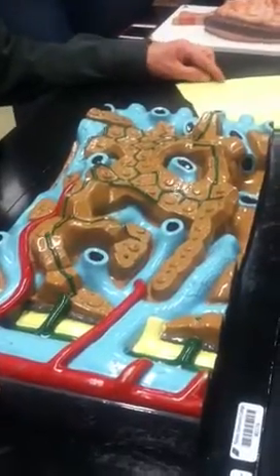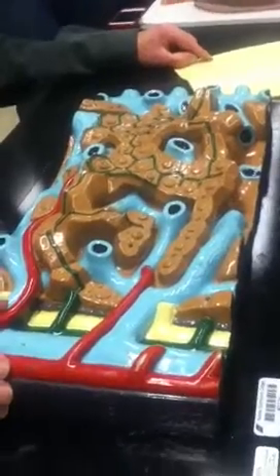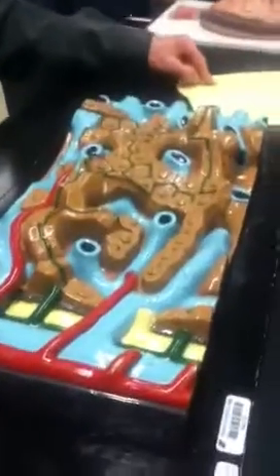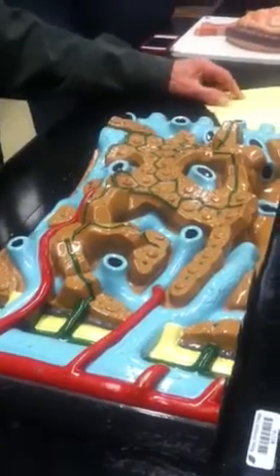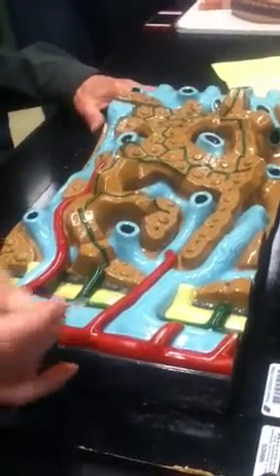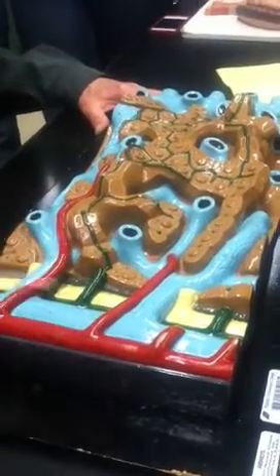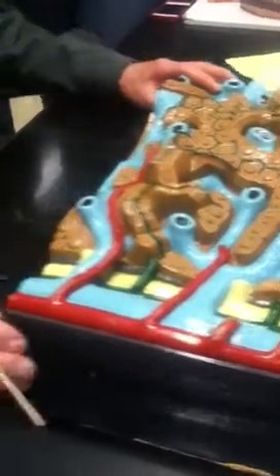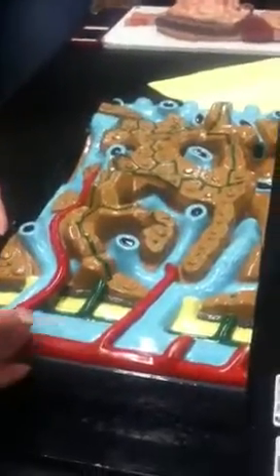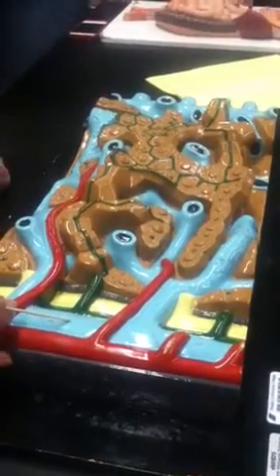Let's go down the line with liver histology. So first I indicate the venule from the hepatic portal vein. The venule from the hepatic portal vein would be this thing. Okay? So this thing comes from the hepatic portal vein. Now I want you to notice something. This is the hepatic artery. This is one of the branches of the hepatic portal vein.